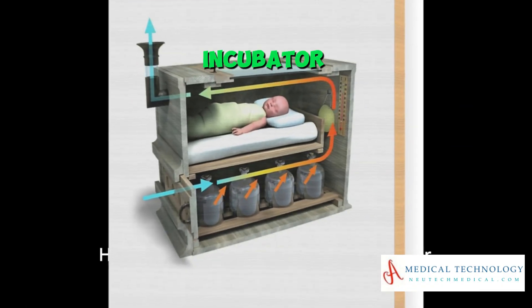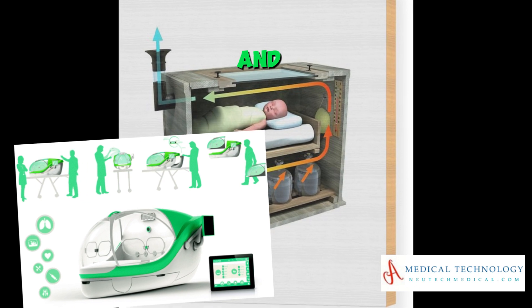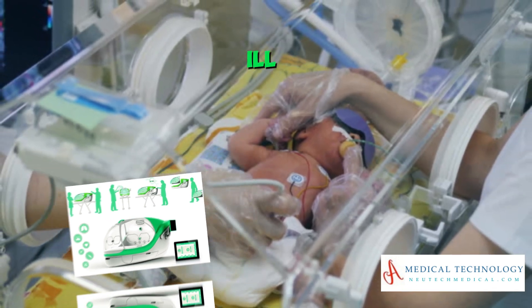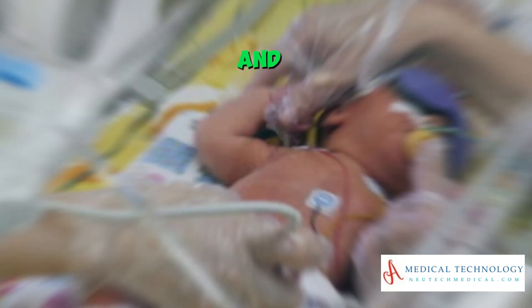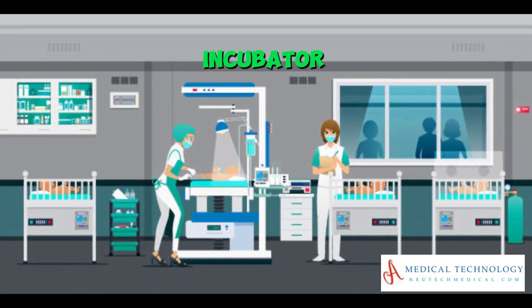Operation and use of a baby incubator involve careful attention to maintaining a controlled and supportive environment for premature or ill newborns. Here are the basic steps and key considerations for working with a baby incubator.